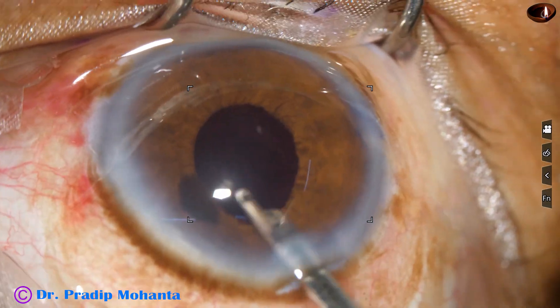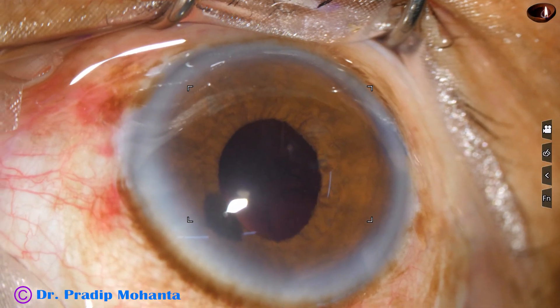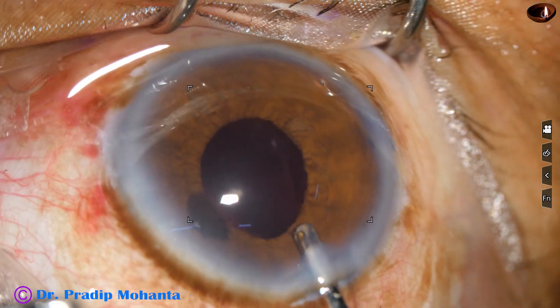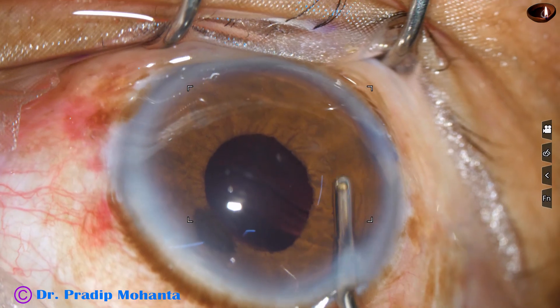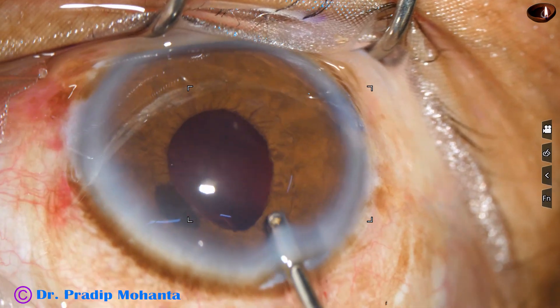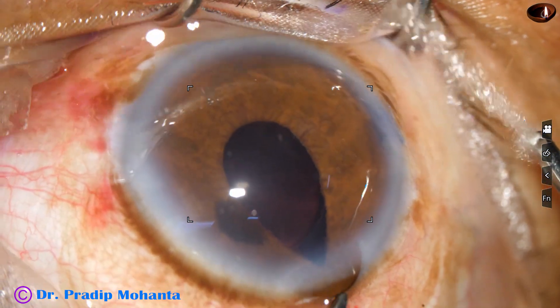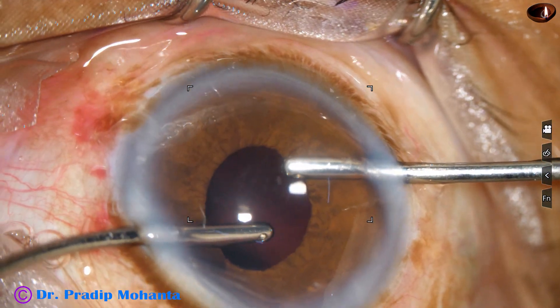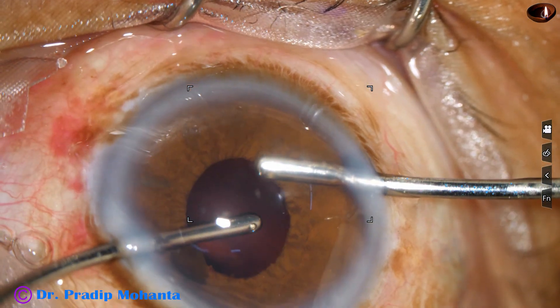Now we are going to remove the visco thoroughly. I have used the Simcoe cannula for some time for removing the visco. Now this is the irrigating cannula of bimanual irrigation-aspiration probes. All the visco from the anterior chamber angle has been removed, and now irrigation and aspiration are being used together to remove all the visco.